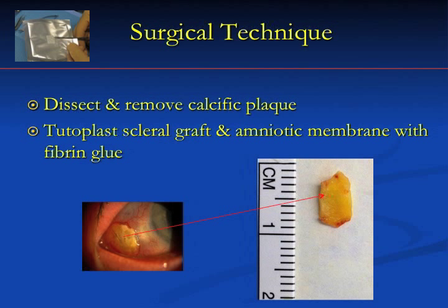Not only that, but as I was cutting and dissecting more and more, my heart rate was going up and up. It was not ending practically. So I had to cut part of it, most of it, as I was removing it, because there was still something left and I couldn't bring everything out. So as you see over here, this portion, and you see here the bar to measure it, it's about 2/3 of the whole length of the plaque that was present. I didn't put the other part.